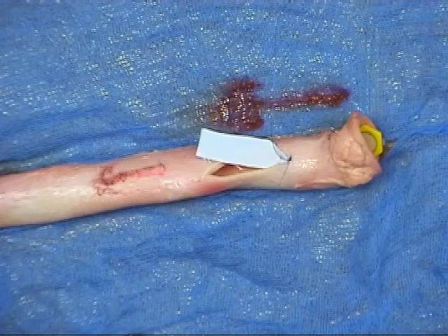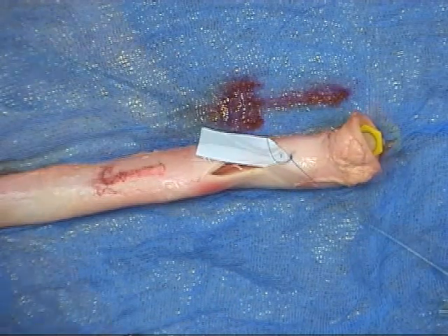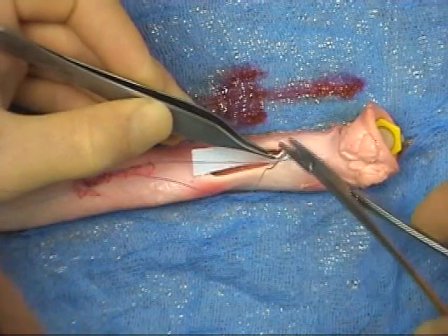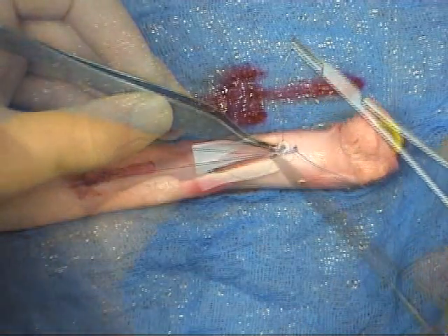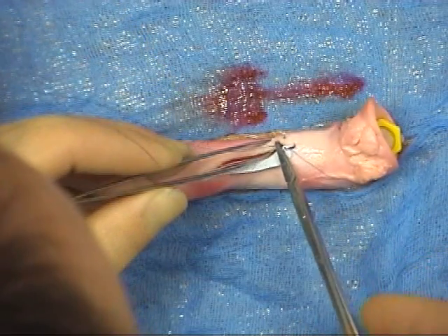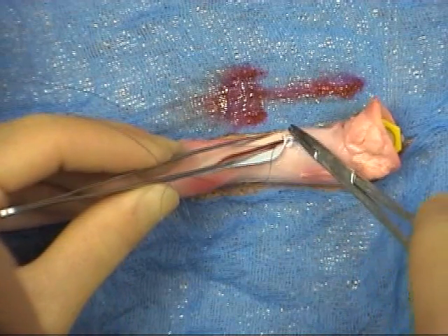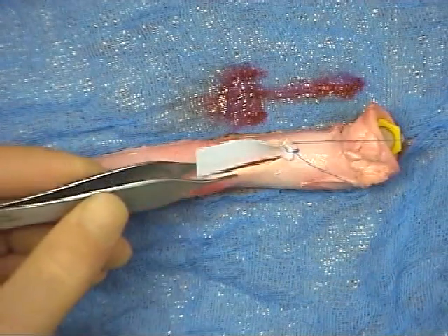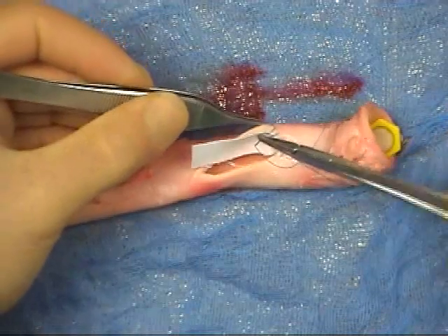One long thread is then held in a rubber shod haemostat, as a regular instrument could damage the suture material. With the assistant taking up the slack in the other thread, and the needle held in a reverse fashion, further bites are placed through the graft and vessel wall. The needle is again passed from inside to out, and the distance between the bites is roughly three millimetres.